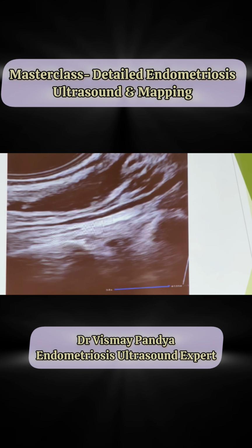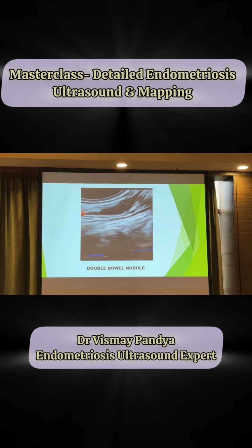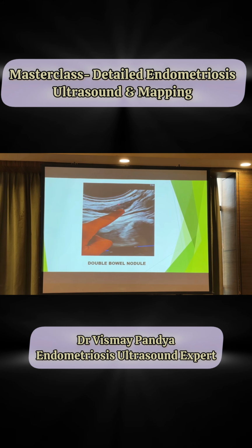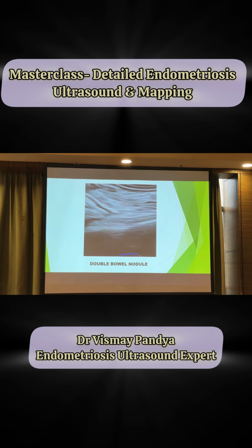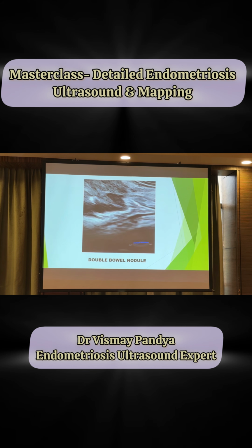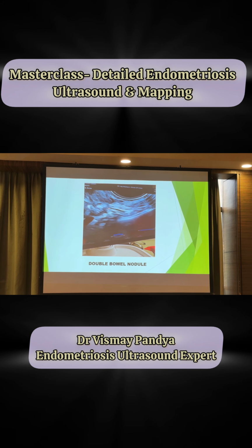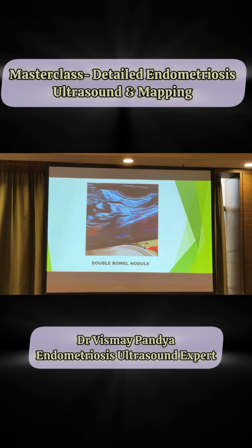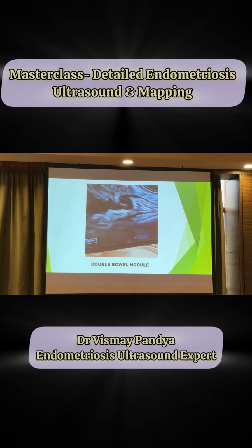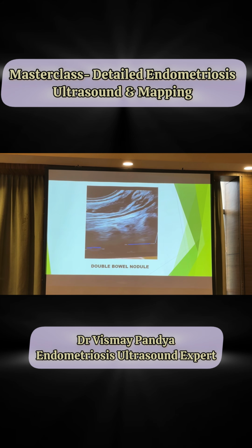Okay. This is a double bowel nodule. You can see there is this bowel nodule here. This is being demonstrated by Jay sir. You can see. So this is the lower rectal nodule, and as we go up now, we will see a different bowel nodule here. Okay. We did a double discoid excision for this patient. You can see two separate nodules. If these are very close to each other, you need to mention the distance between them, because some surgeons also prefer to resect those nodules in one segment.